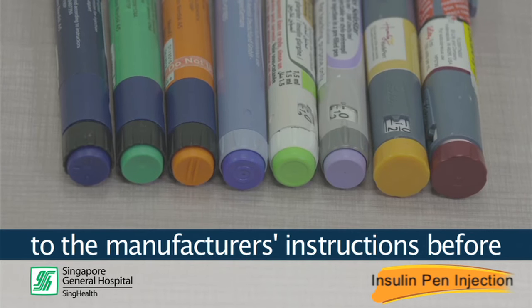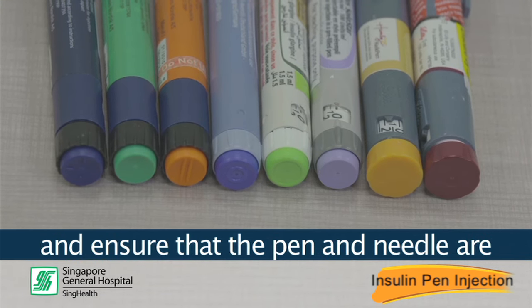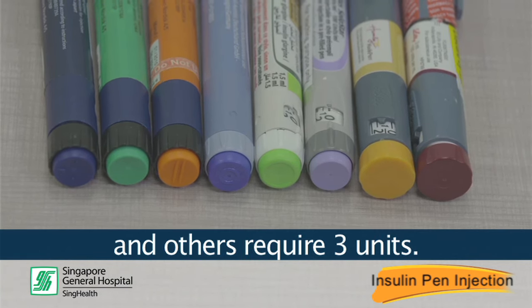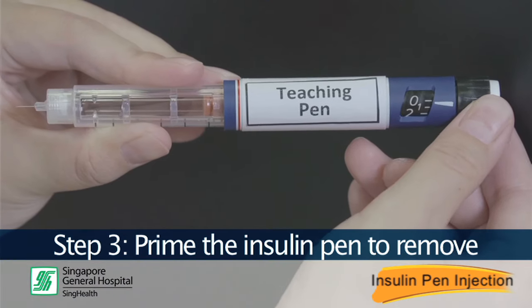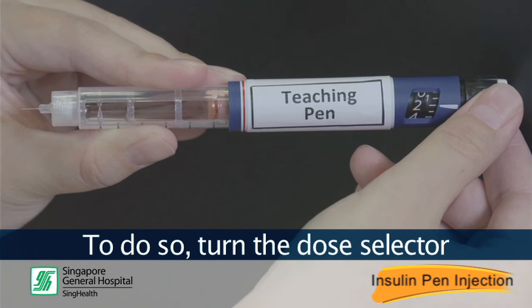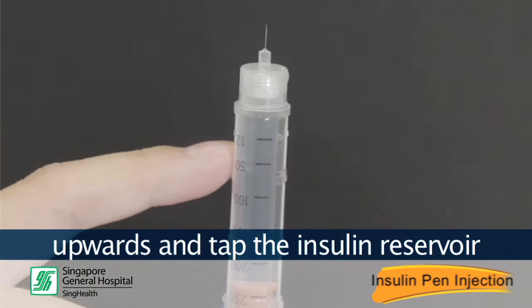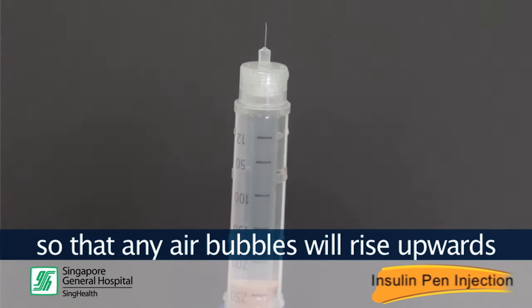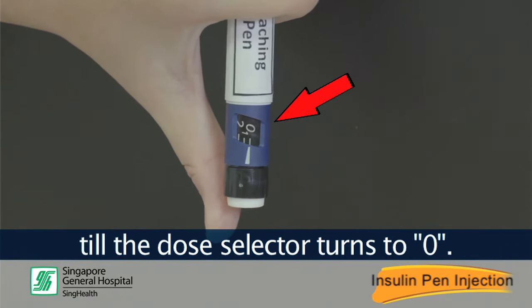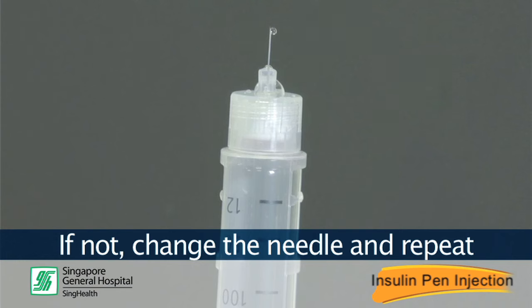Pen devices should be primed according to the manufacturer's instructions before each injection, to remove any air bubbles and ensure that the pen and the needles are working properly. Some pens require 2 units and others require 3 units. Step 3. Prime the insulin pen to remove air bubbles and ensure that the needle is working properly. To do so, turn the dose selector to 2 units for this pen. Hold the pen with the needle pointing upwards and tap the insulin reservoir so that any air bubbles rise upwards towards the needle. Press the dosing button all the way until the dose selector turns to zero. Check and make sure you see a drop of insulin appearing at the needle tip. If not, change the needle and repeat the priming.